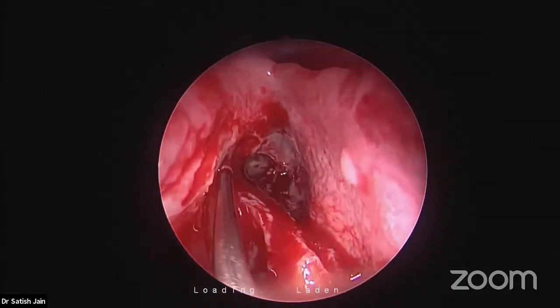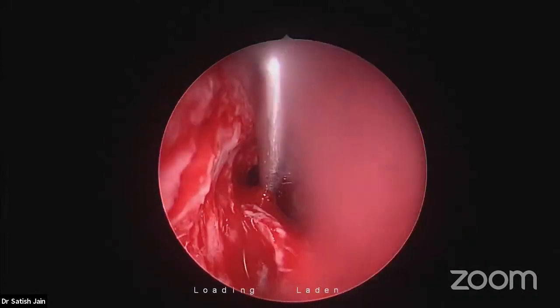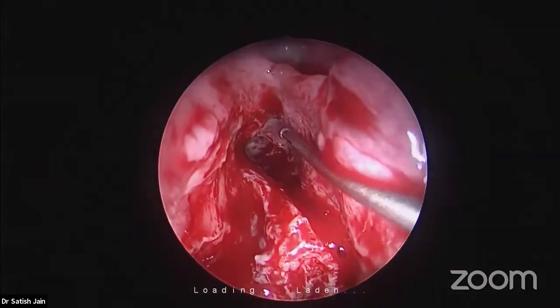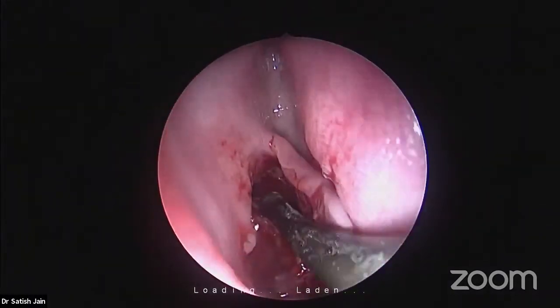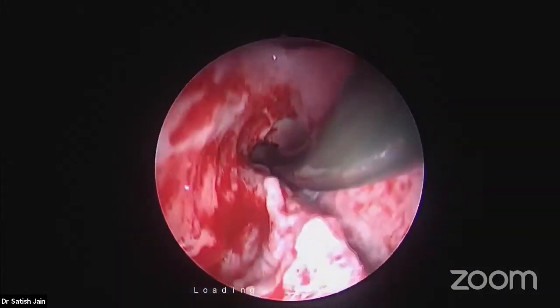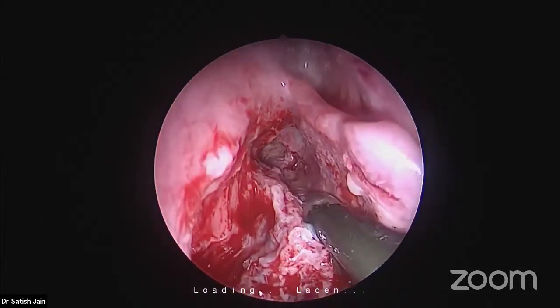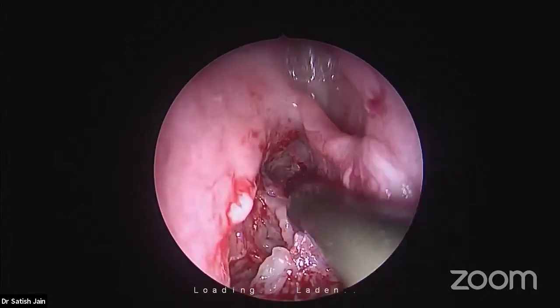What you need to see is stay between the lateral limit and medial limit, go along the beak where it ends in the frontal. And you are working in the anterior trajectory. Your anterior ethmoidal artery is miles away. It is in the posterior most part of the ethmoidal roof. Once you are working in this region, you don't need to be terrified of the anterior ethmoidal artery. First, the beginning of the ethmoidal roof is more than a centimeter behind the beak. And the end of the ethmoid is going to be the anterior ethmoidal artery. So don't get terrified.